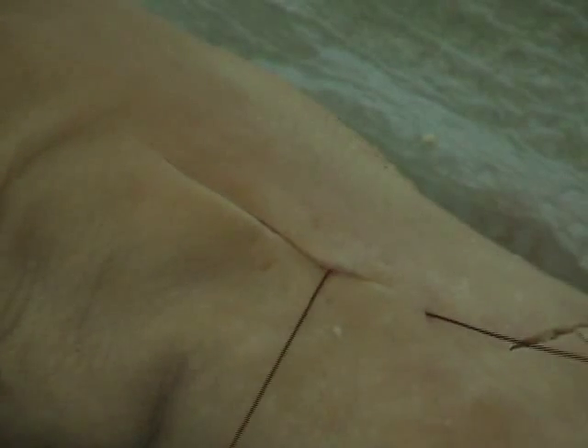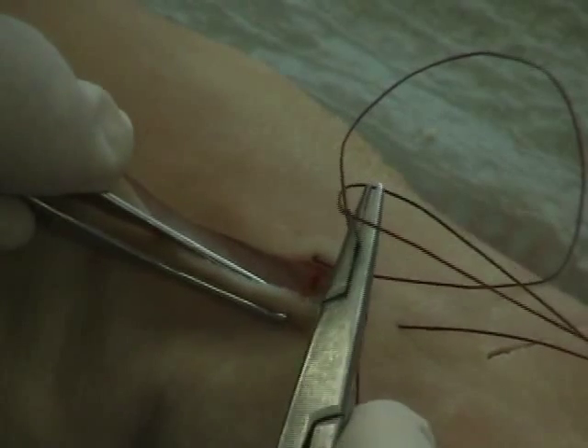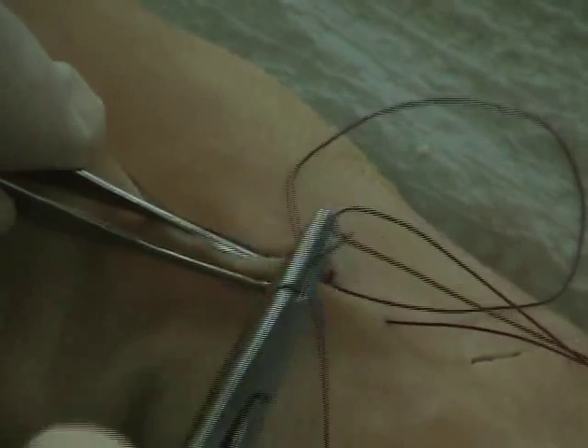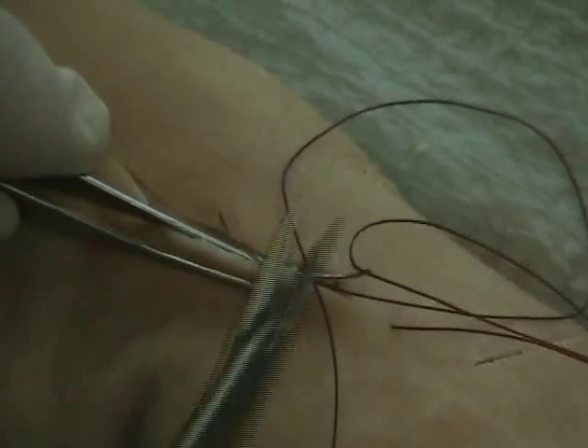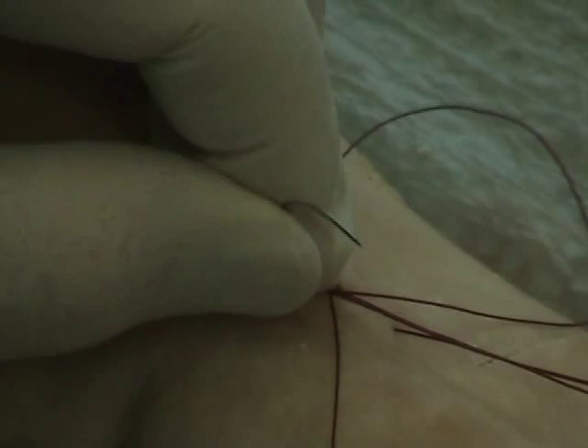You're looking for the stitches to be approximately an eighth of an inch to three-sixteenths. Once I go on one side, I pull it across to see where I need to line up on the other side. I turn the skin up on that side, dig into the skin a little bit, and then pop out on the other side — directly across from where it came out on the first side.